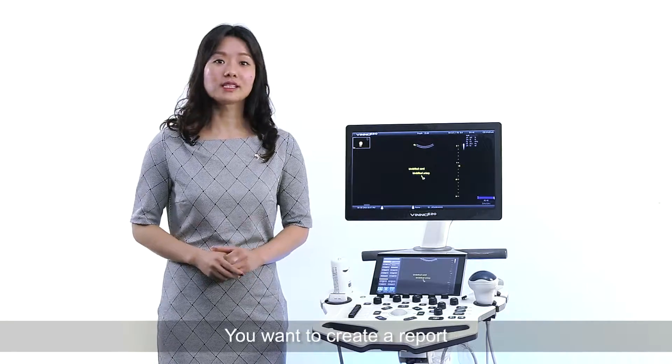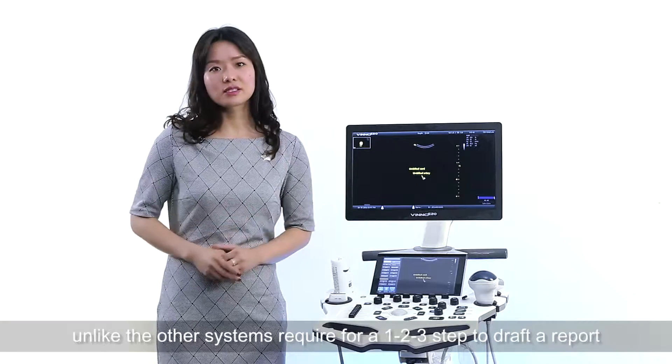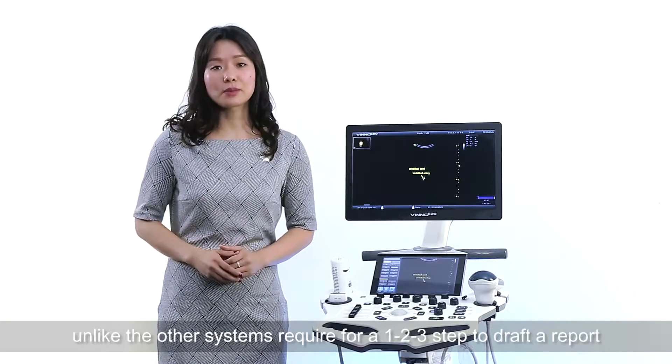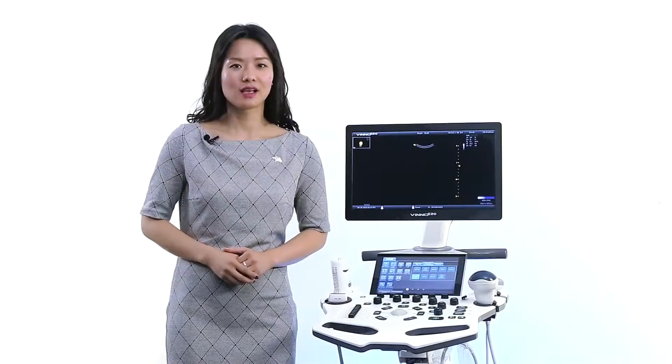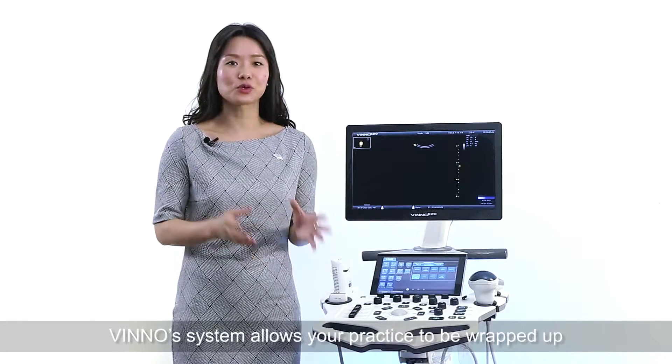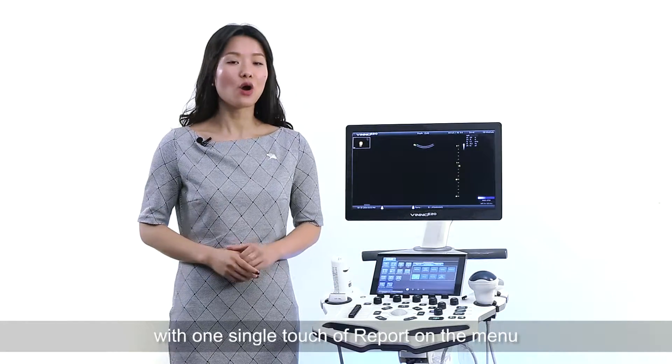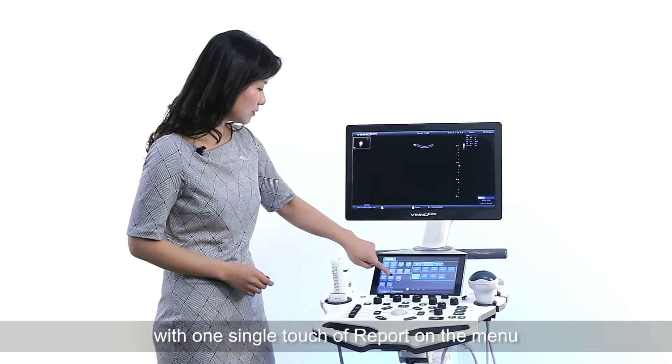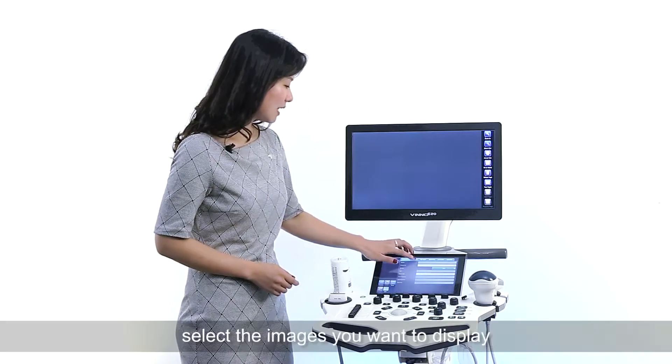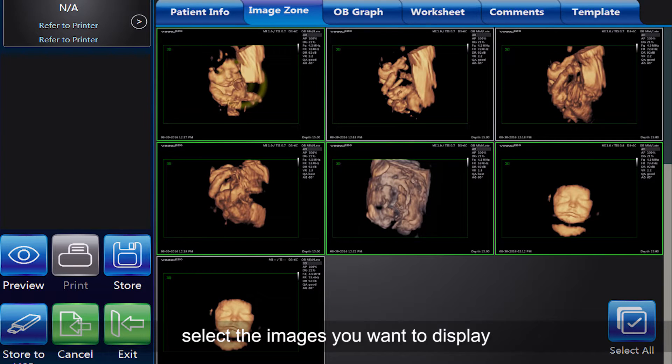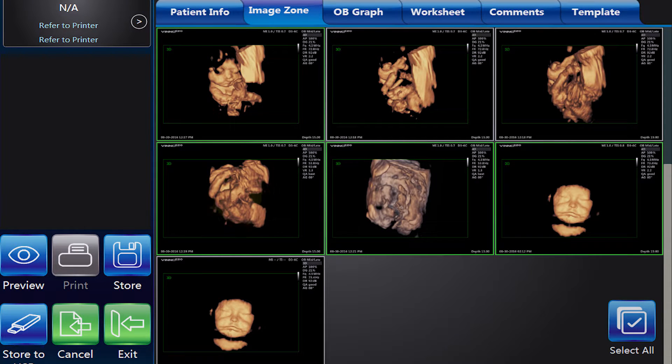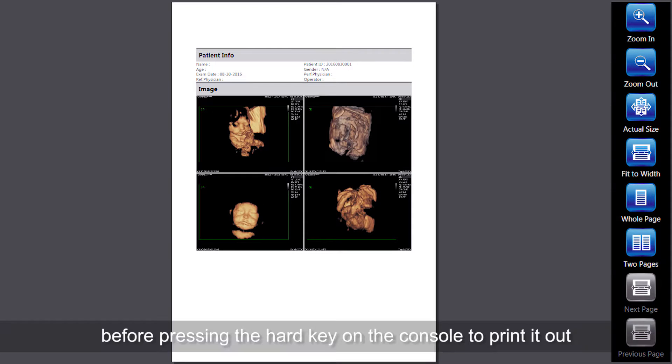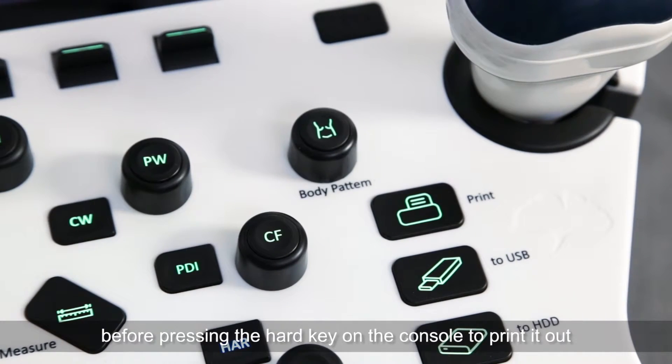What's next? You want to create a report. Unlike the other systems that require one-two-three steps to come up with a report, the Vino E20 allows your practice to be wrapped up with one single touch of report on the menu. So select the images you want to display. You're able to preview the report before pressing the hard key on the console to print it out.